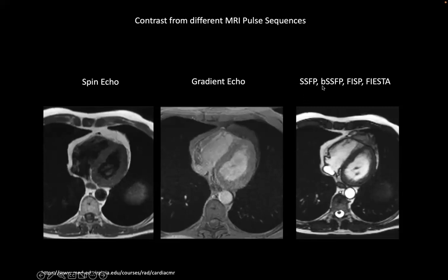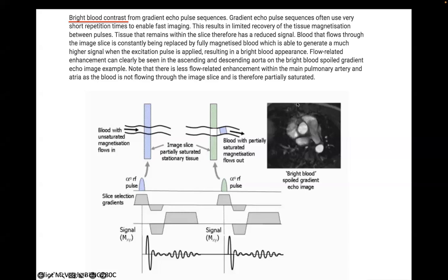And then these are sequences in which the radio frequency pulses here are brought very close together. And that's why we need these gradients to switch at such high rates. Remember, we talked about switching from here to 50 millitesla per meter over here in about 250 microseconds, right? So you want these ramps where you're not sampling to be as short as possible.